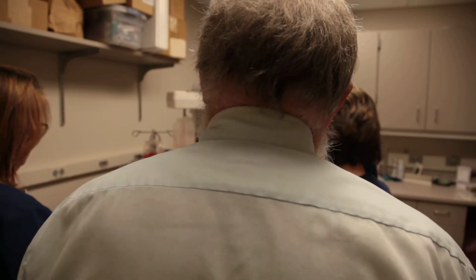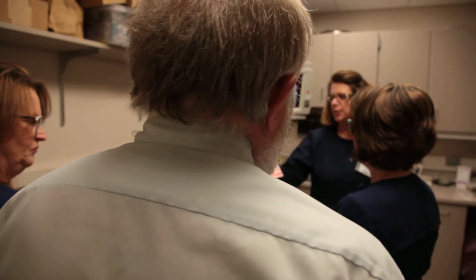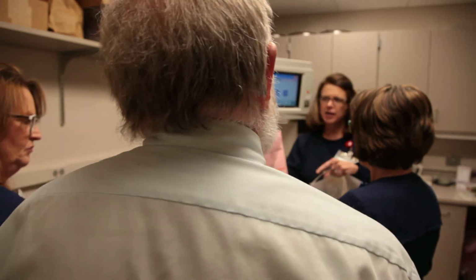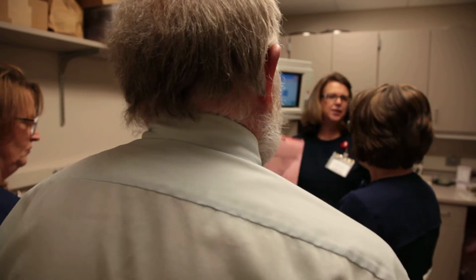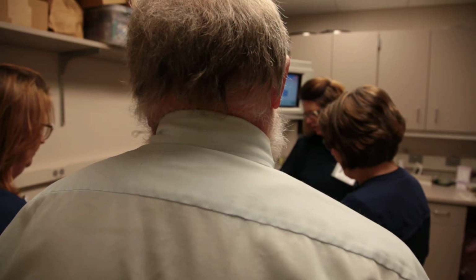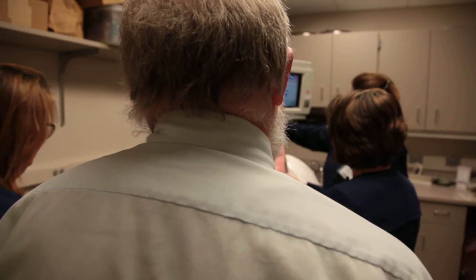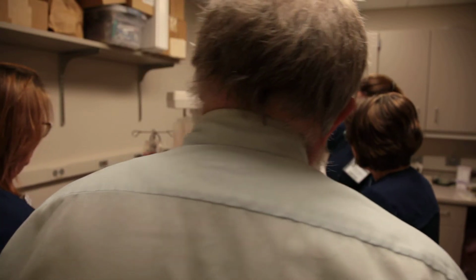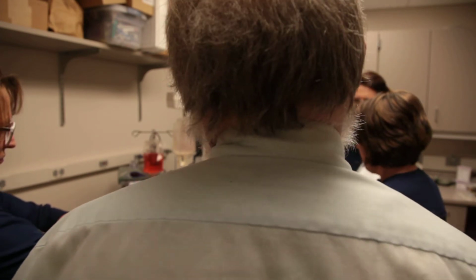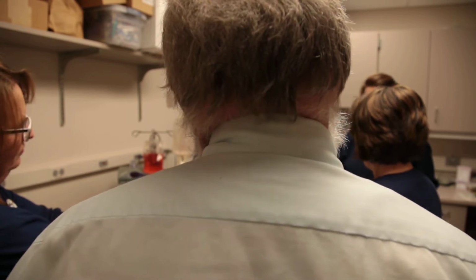And then of course, you know how you're gonna order your blood. What we've come up with, each machine says a specific amount, like Amicus is 250. But I think a lot of people are just ordering 300 mils, because then it's gonna cover you, you've got plenty of it. So that's what we're gonna do, is just order 300. And then of course, you've gotta fill it out like usual, make sure the patient's weight is on there, and say that it's a blood prime, and that's what the nurse is gonna give. That's one thing they always specify, and then it's irradiated. I don't think all of it's irradiated, but anyway, we still mark that. So you're gonna be filling both these things out as part of the process.